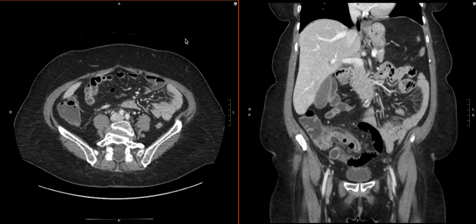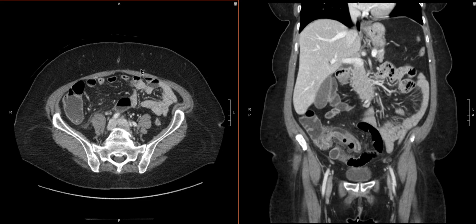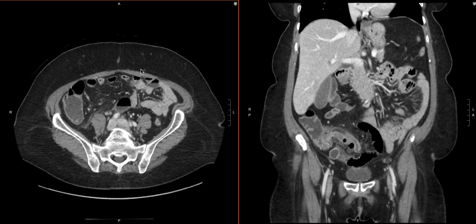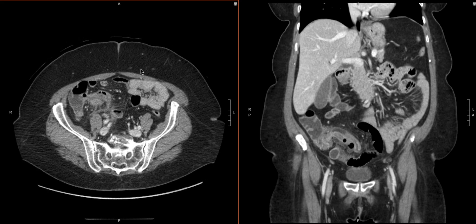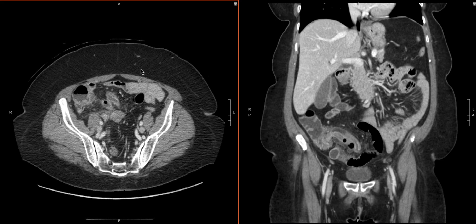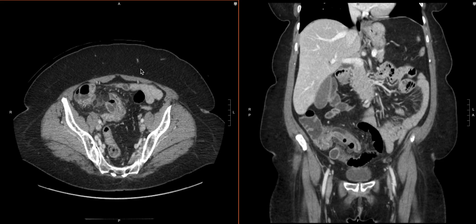We're going to show how we detect the perforation and specifically what we're looking for. We have a case here — CT abdomen pelvis with contrast. We have our axial and coronal views. Just to review, when we're looking at appendicitis cases, we want to identify the terminal ileum and the ileocecal valve just as a landmark.